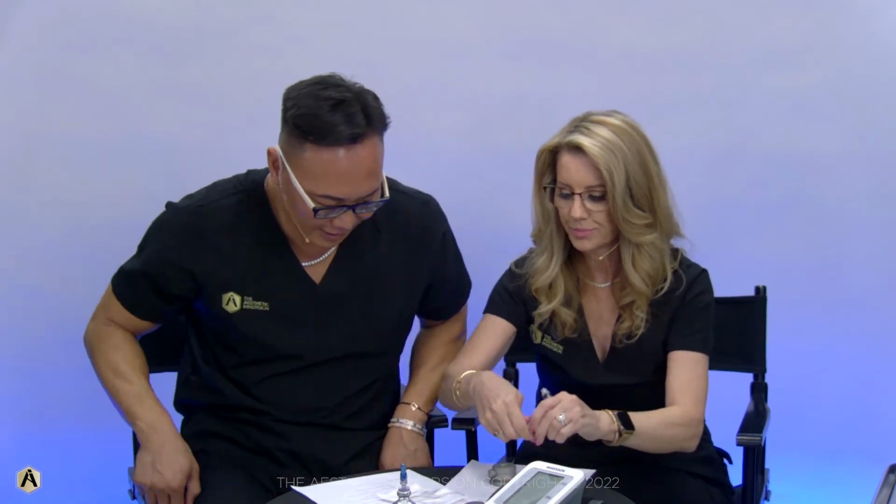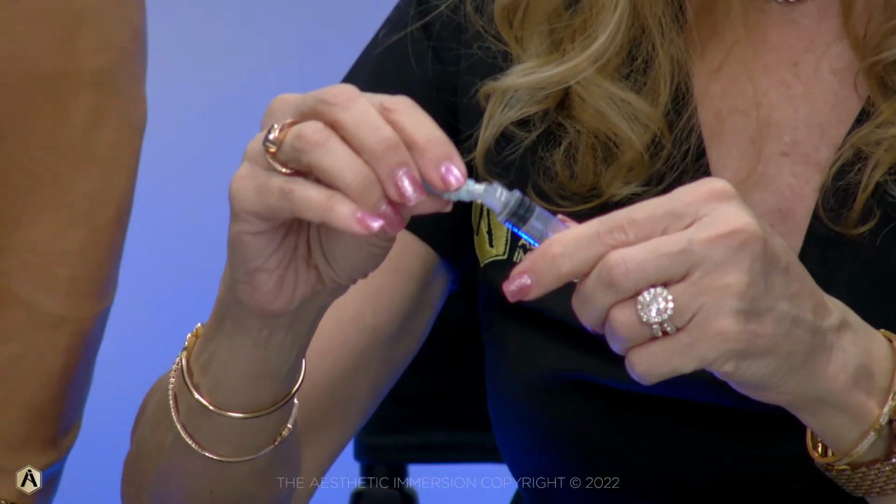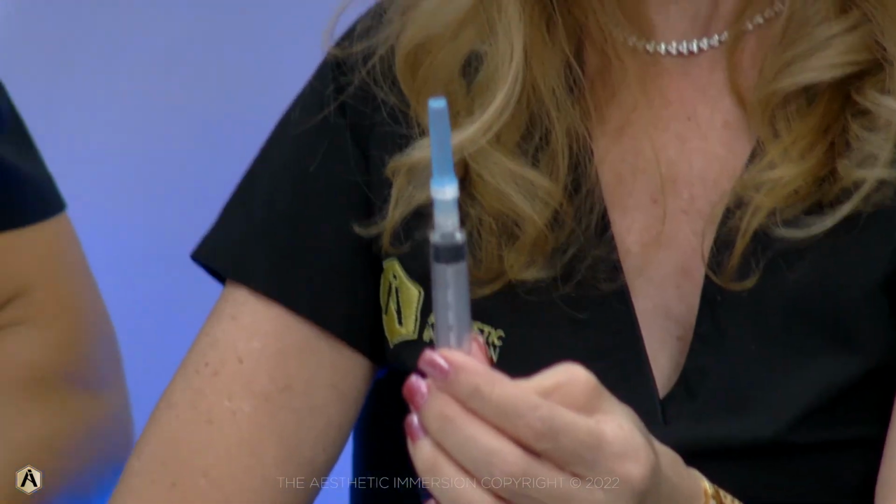Okay, I love this. Do you have anything else in your bag of tricks? I don't have that many things. Do you use these? I love this. This is a needle holder, and I used to think, okay, whatever, I don't know if I'm going to use it. But let me take this needle off. Here's what I do when I'm doing threads and throwing stuff all around. Here I have my needle.